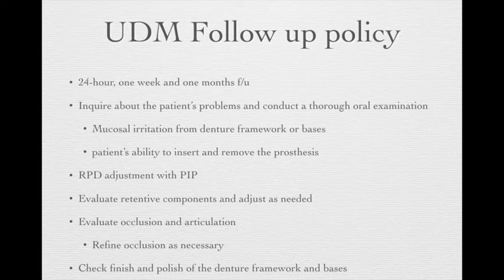If they have any mucosa irritations, you have to adjust it with the PIP paste. You also need to evaluate the retentive components, and if they lose retention, you have to do some adjustment. After that, you have to evaluate occlusion and articulation. Always remember that when they start to use the denture, the denture teeth start to wear out.